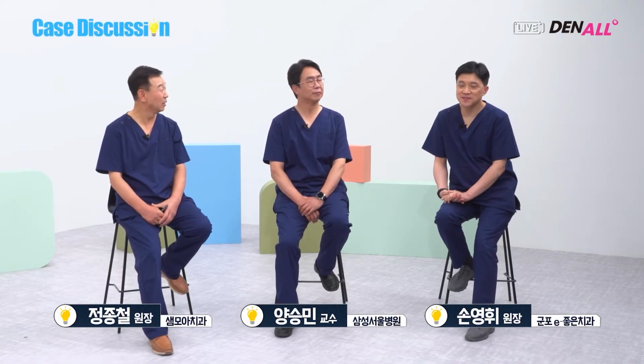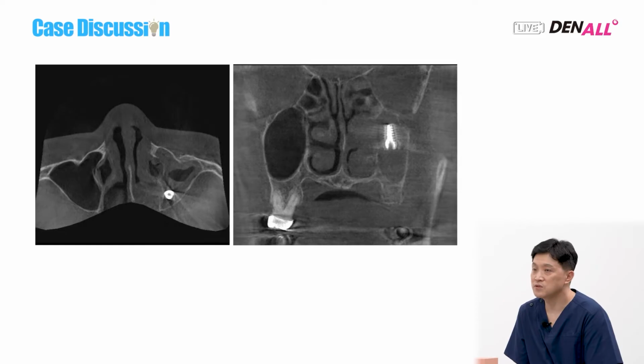When the implant fixture is dislocated in the sinus, there are two occasions. If it is dislocated during surgery, it's easier to remove it using suction. But if it was dislocated a long time ago, there can be granulation tissue or hypertrophic mucosa.